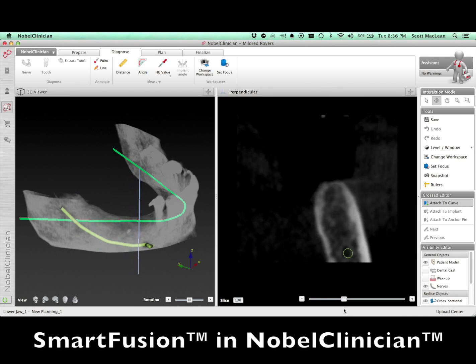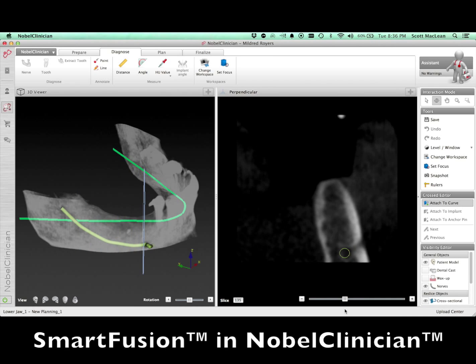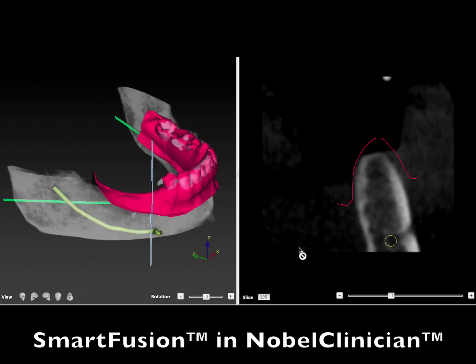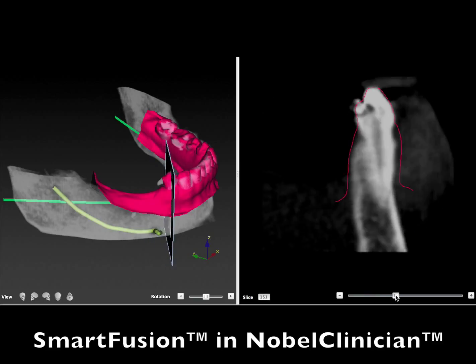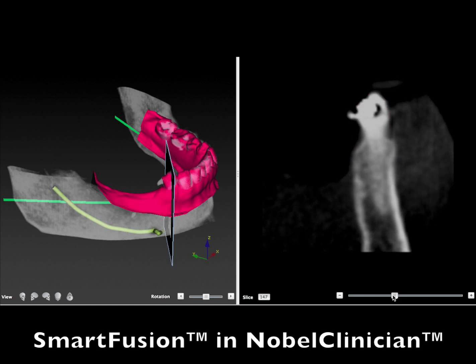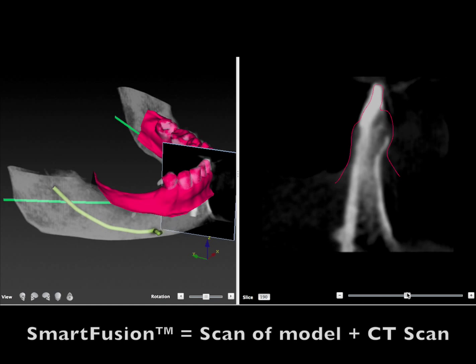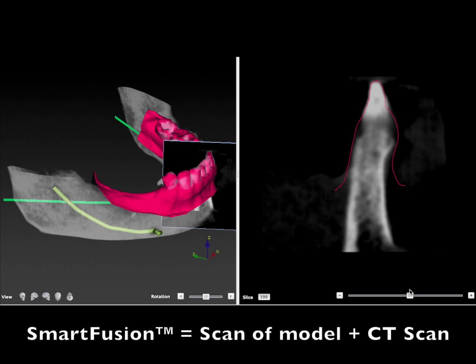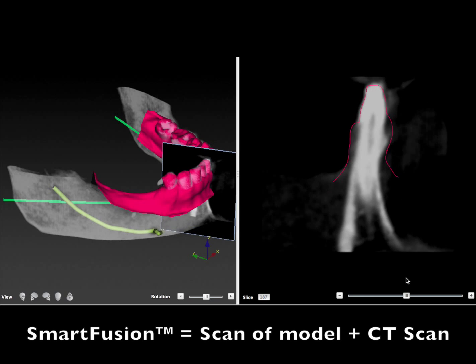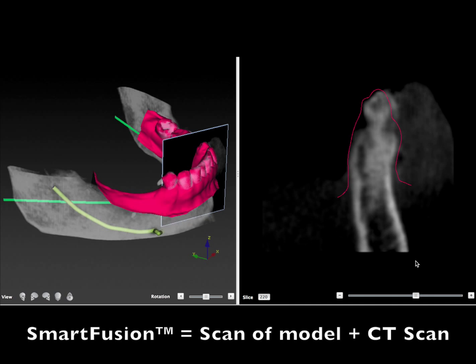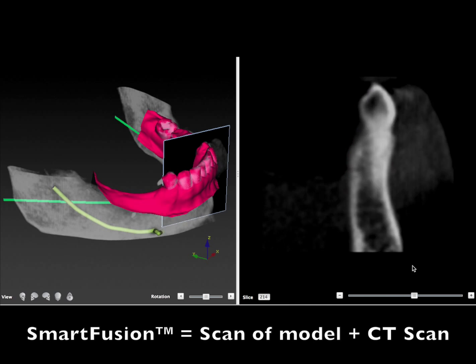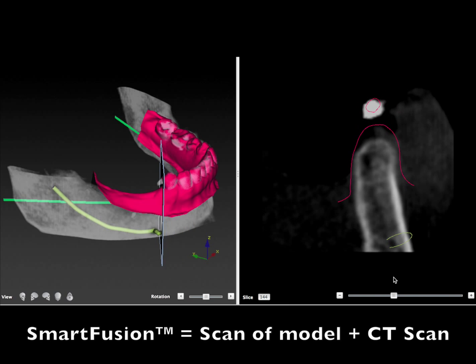One of the things I like to do is what's called a smart fusion, which means to bring a scan of the model back into the scan of the patient. So the CT scan gets fused in with the model of the patient, which is scanned on a 2G scanner. When you put these two together, it's called a smart fusion, and this allows us to see where the teeth and the soft tissues are relative to the nerve, the bone, and where we're going to place the implants.